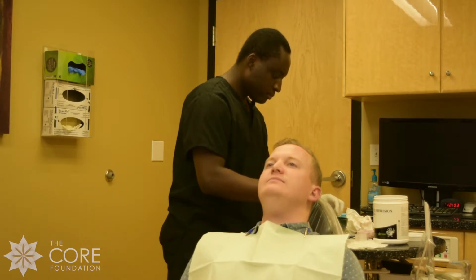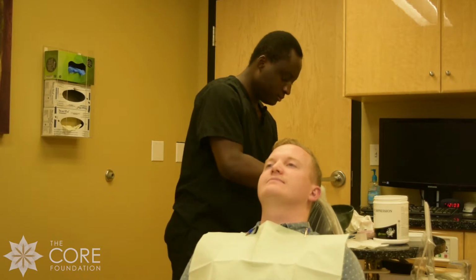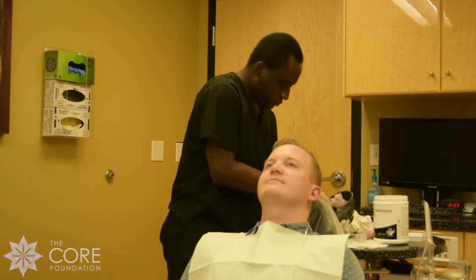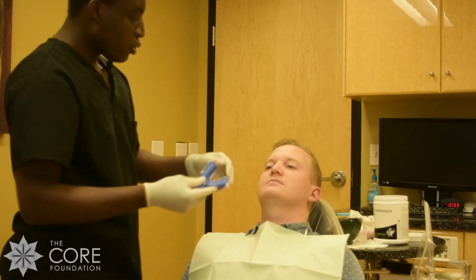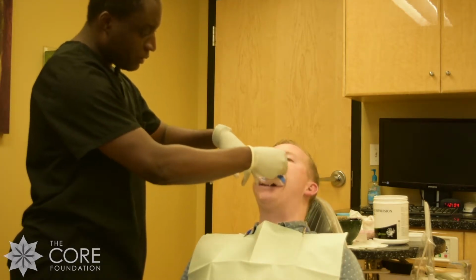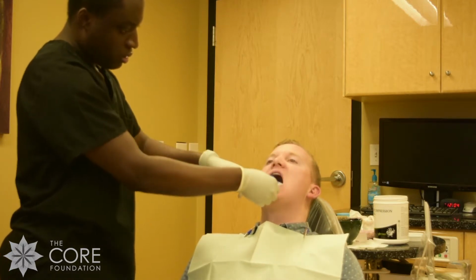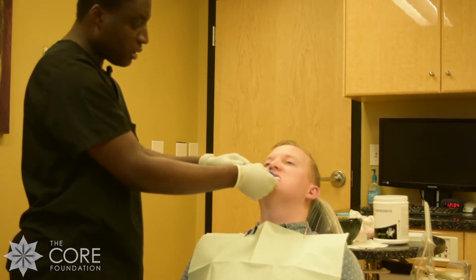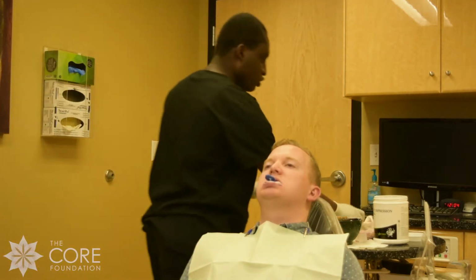We're going to redo the bottom. Same steps as the overhead technique. We'll come right over, see the patient, go ahead and open, retract. And then go ahead and bite down really hard. And then slowly move the lips around to make sure you get a nice flap over for your bottom impressions.